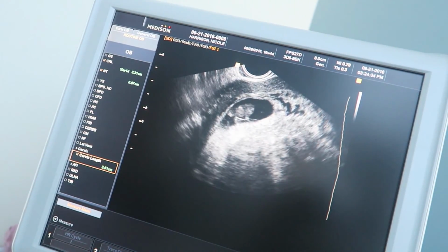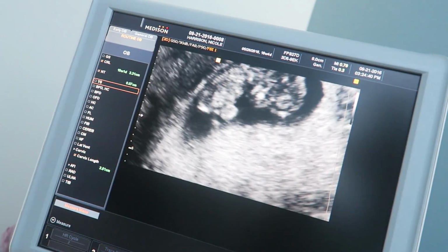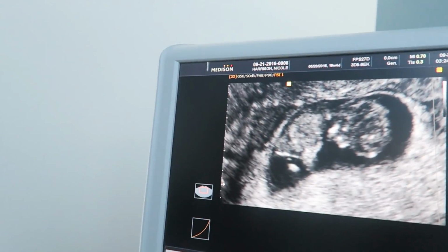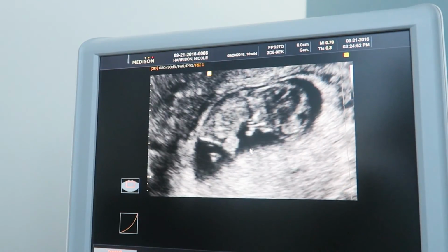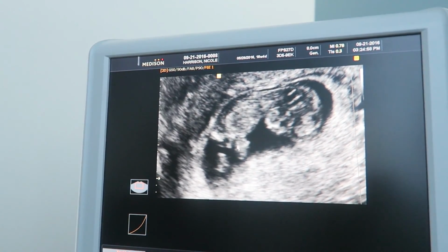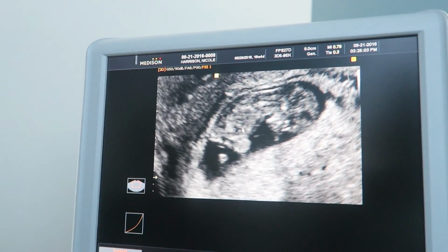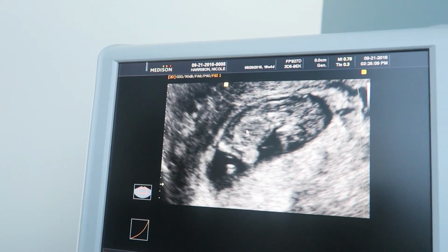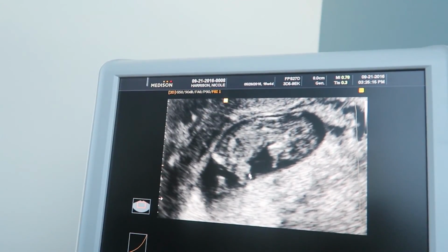Your little one is now awake, so I'm going to aim back up at it and make the image bigger. And of course now it's going to curl up and go to sleep. There we go. So now the head's at the other end, so we change the angle. It's looking away from the probe. It's a backwards profile. Again, where the cord comes out of the body, its belly button, which is right here, is big and prominent. Because actually what happens at this stage, which is normal, is the intestines actually come out of the body and go up into the cord, and then they rotate and go back in. So on the next ultrasound, we look at that area very carefully and make sure all the intestines went back in. But that's why this is kind of bright and bulgy here.